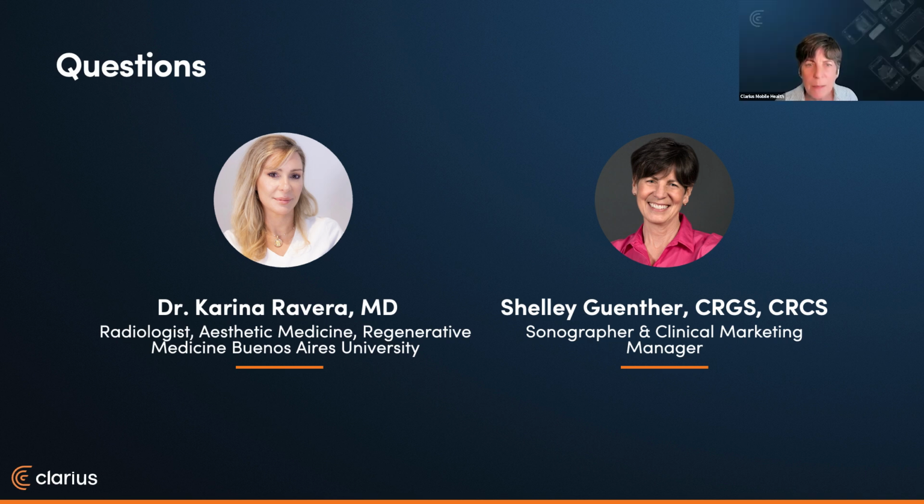Karina, there was one question about Sandy was asking why T-mode doesn't work sometimes. So it should work. I mean, the T-mode is only available right now in the cheek, the temple, and the lips. But if you're having an issue, maybe reach out to our support department and see if we can get you straightened around.